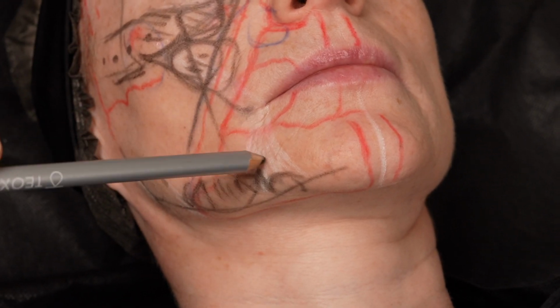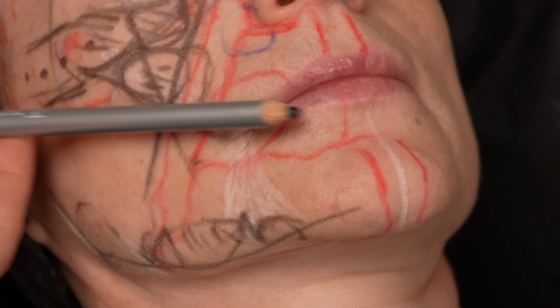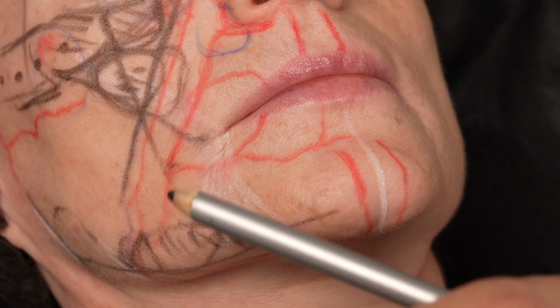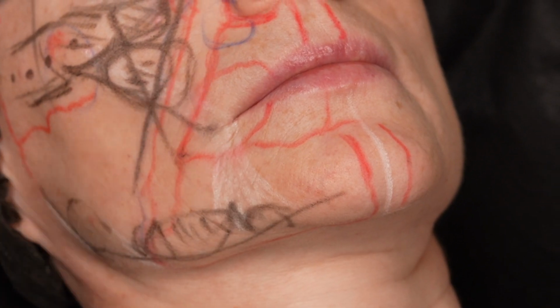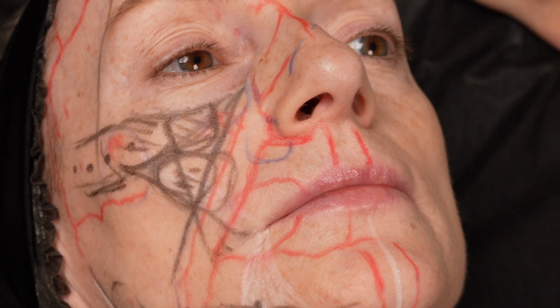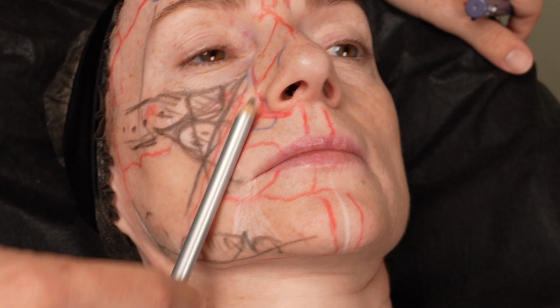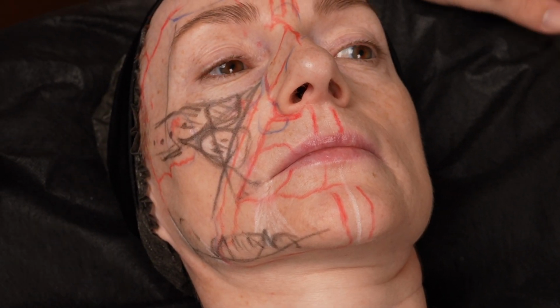Also for marionette correction, you can enter from here to inject with a fanning technique, or you can enter from here and inject like this to correct the marionette. But if you want to correct at the same time the nasolabial fold and also the marionette fold, this entry point makes sense. You can go lower, you can go up, you can correct both the nasolabial fold and the marionette line at the same time.